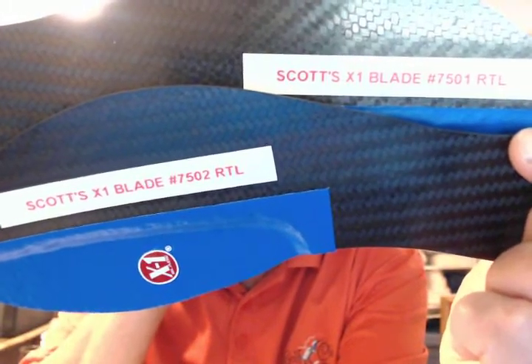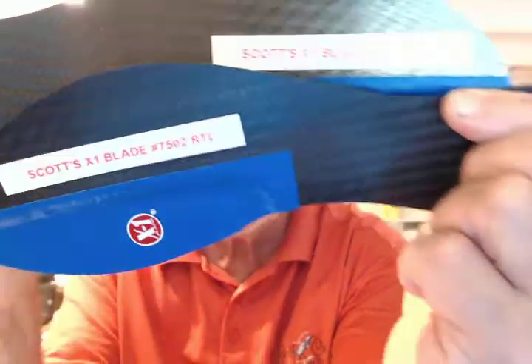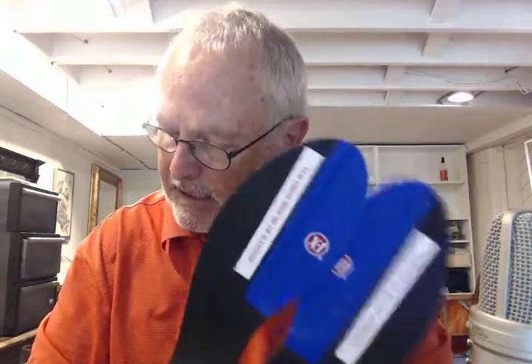It's ClydeIndianaBrace.com, got a pair of X1 blades, 7501 and 7502, going to Scott in Winthrop, Washington, and he's got a Hallux Limitus runner with bone spurs.